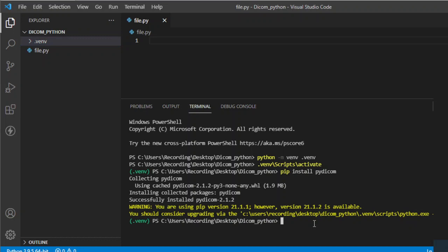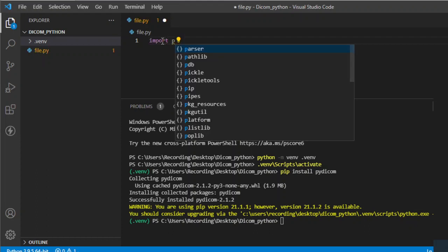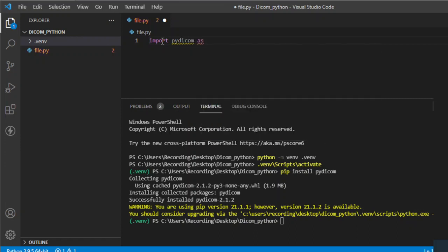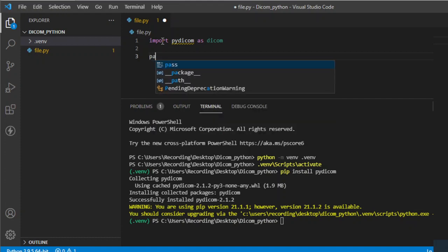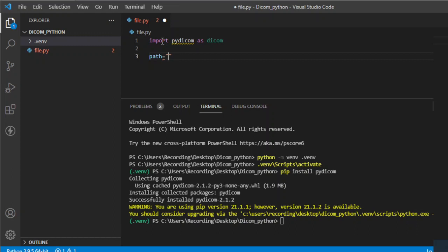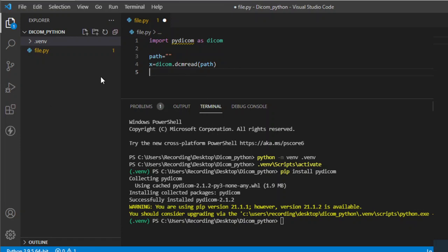Now we're done. We're going to write our first very own code. To do that, we need to import pydicom — I'm going to represent this as DICOM. We also need the path of the DICOM file. For now, we don't have the path yet, so I'm going to reserve it here. Then we need to call that and assign it in a variable, DCM, using pydicom's dcmread and the path.